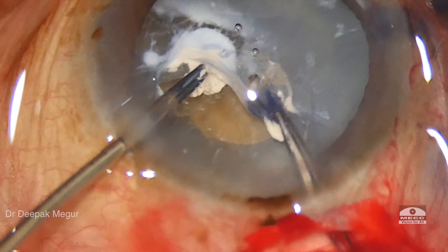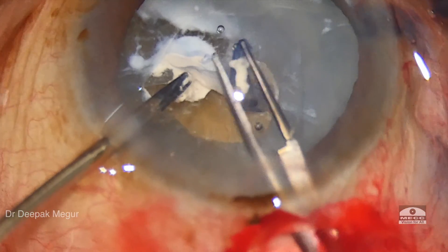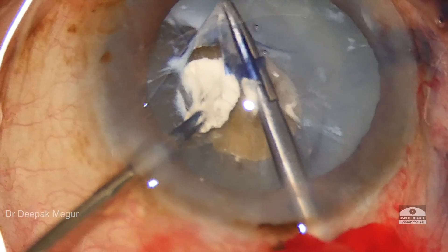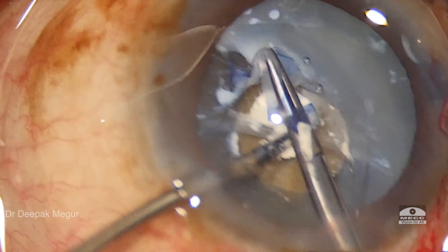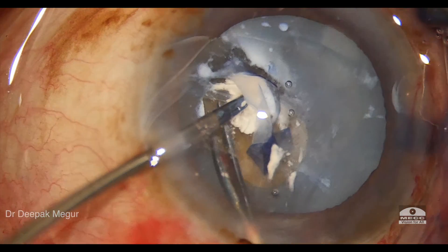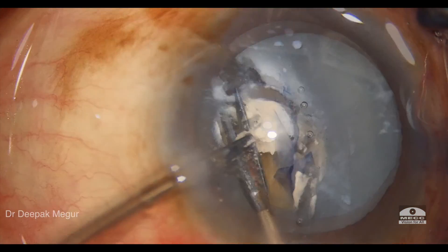I need to resort to my micro scissors and forceps to hold the calcified plaque and try to separate it with two forceps, and eventually I need to use my scissors to dissect out and cut this fibrotic band.